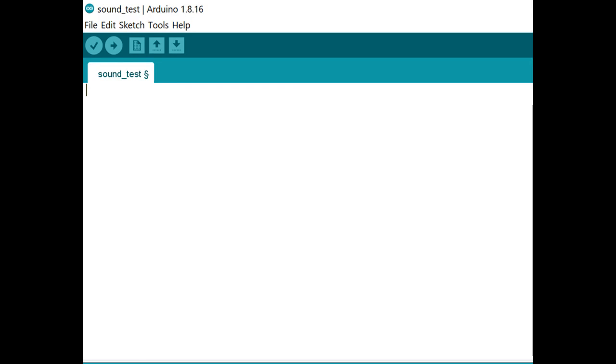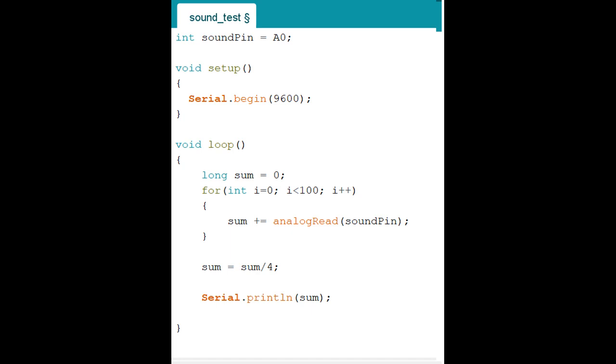So when you start programming or coding, there's no space. When you give a space, or we call it indentation, there's a special place that we call it body. So let's just start typing int, int, all small letter. It means integer, so it's a number, right? Integer is not decimal, it's integer.